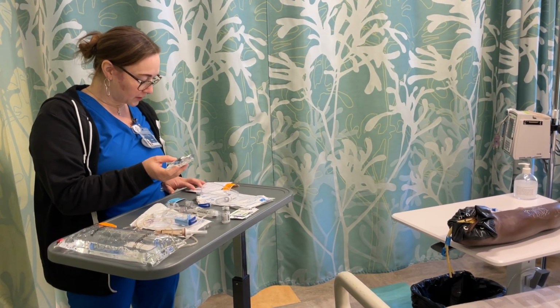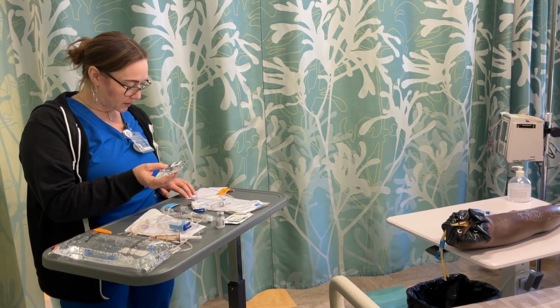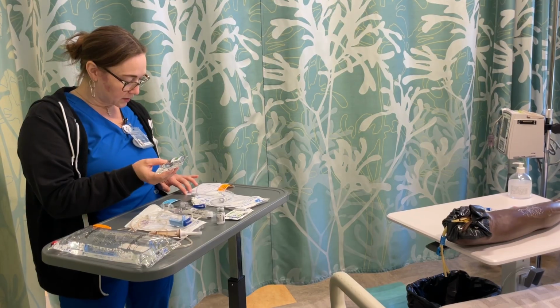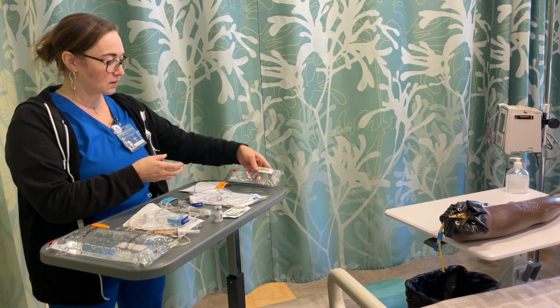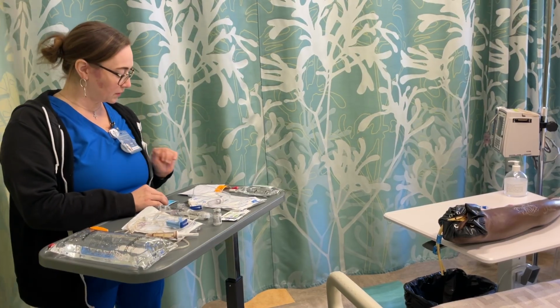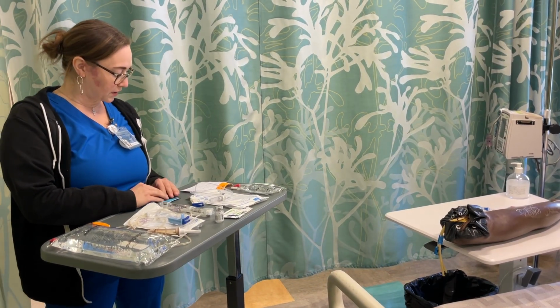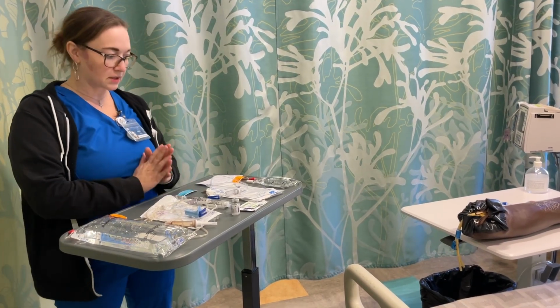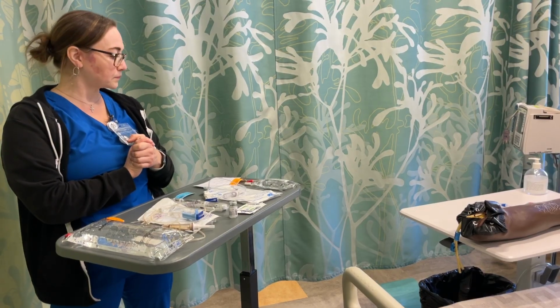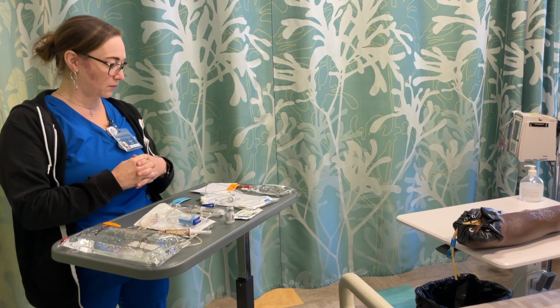with the calculations and everything that will be infused. It'll be at 6 drips per 15 seconds, so over the course of a half hour. And then she's also going to have an IV push. Last time she had some nausea with the antibiotic.